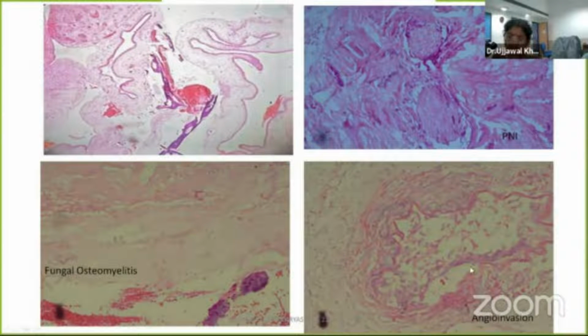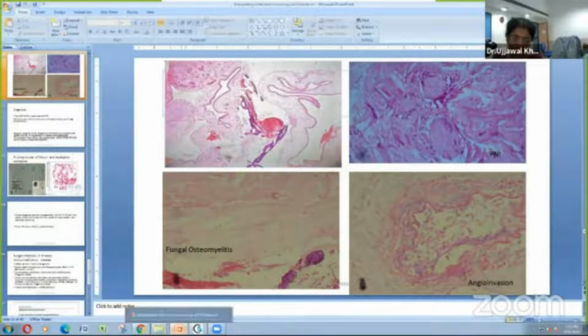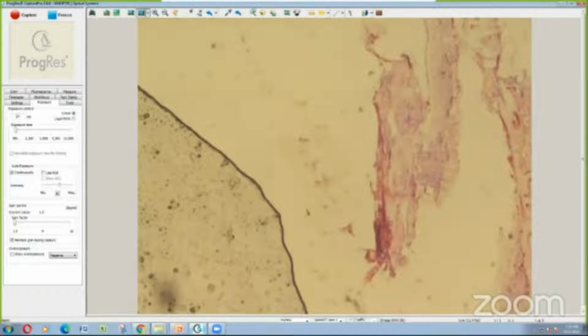And so these sporangia, as Dr. Arti had also highlighted, these sporangiophores can become pigmented in Mucorales, and there is this formation of a columella, and they are pigmented sporangia. Although Mucor itself is not pigmented, the sporangia formation is pigmented. They are much larger, like 90 microns, and Aspergillus would be very much smaller.